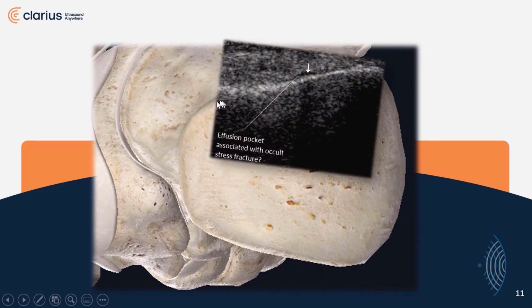Appreciate with me the white line of the bone, and look close, you'll be able to see a dark area that makes a very small dome, and that dome correlates not only to a change in the bony matrix, but it is also directly located at the point of maximal pain.